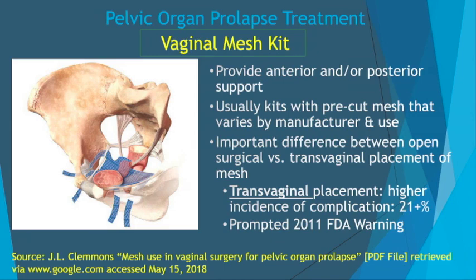However, more recently, we now have pre-cut kits, so surgeons can just fit it into the pelvis, and the shape of the kits just depend on what it is they're trying to treat. The image on your left, again, is a schematic just showing a kind of way that this particular mesh fits behind the organs, and you can see here it tends to be flat and very, very thin.